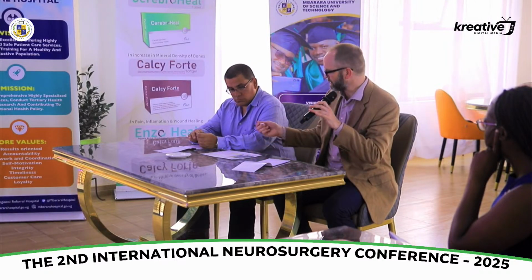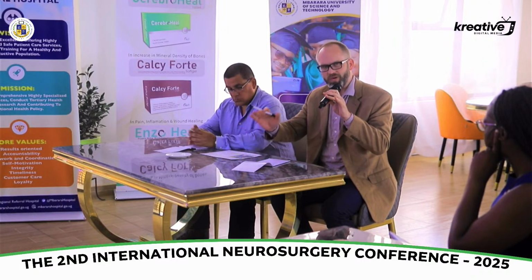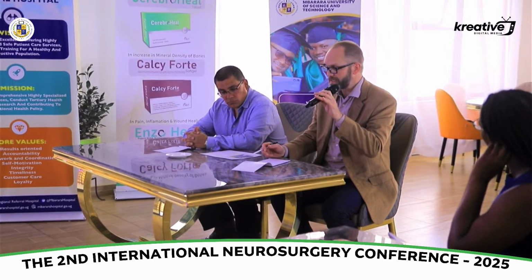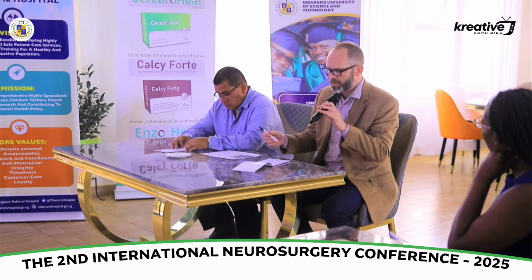ICP measurements I'm going to leave to Dr. Kava, because the most important way to measure ICP, or at least indirectly measure ICP, is with transcranial Doppler and some of the indices with transcranial Doppler. So you don't need the bone off. You use windows of bone through which you can see with vascular imaging, like the temporal window. But he'll talk about that.